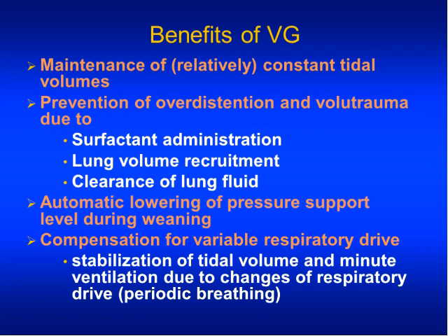We know that volume guarantee will prevent overdistension and volutrauma when lung compliance changes rapidly, as it does in all these interventions listed there. And a very cool thing is that it results in automatic lowering of the pressure generated by the ventilator as the baby's lungs improve and as the baby begins to breathe more actively.